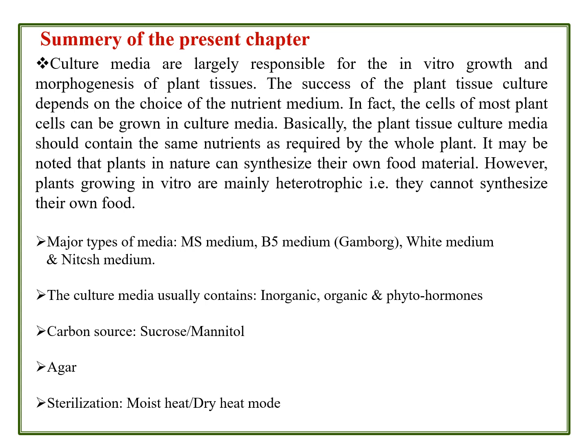And culture media usually contain inorganic, organic and phytohormone components. Both the inorganic and organic substances comprise macro and micro elements that support growth and development. And coming to the phytohormones, those decide the fate of the culture. It depends on the objective taken.